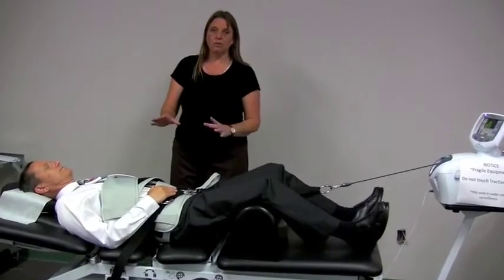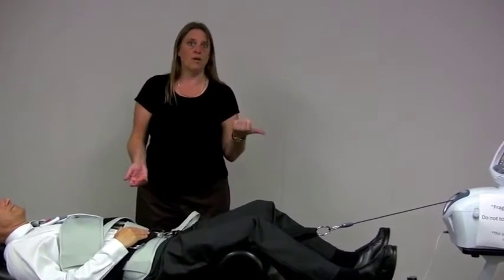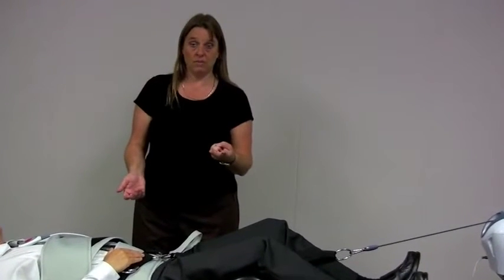So check in with your patient, do your tolerance. This is an easy way to do a tolerance test where I've done a 1-minute progression, 2-minute treatment, and a 1-minute regression to find out if this works for them. Then you know you can proceed. Most treatments are 20 minutes, sometimes 10, sometimes longer, sometimes up to 30. It really depends on the patient, on your purpose of your treatment, and so on and so forth.